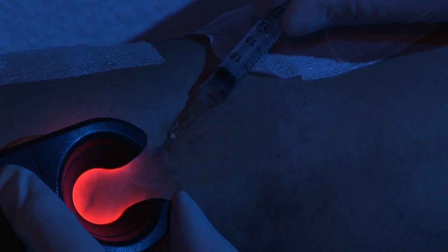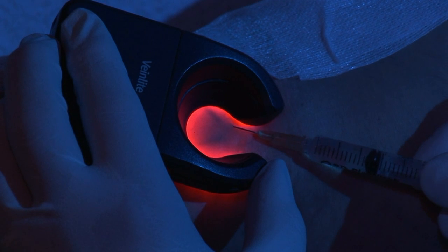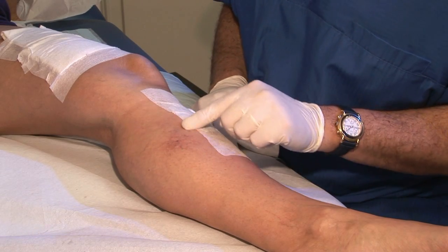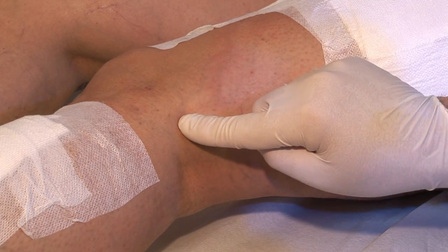For reasons of hygiene, disposable protective covers are recommended for the vein light. To allow better visualization, however, the use of protective covers was deliberately avoided in this film. After the initial decoloration, the treated area usually becomes slightly reddened. This is part of the normal reaction to sclerotherapy.